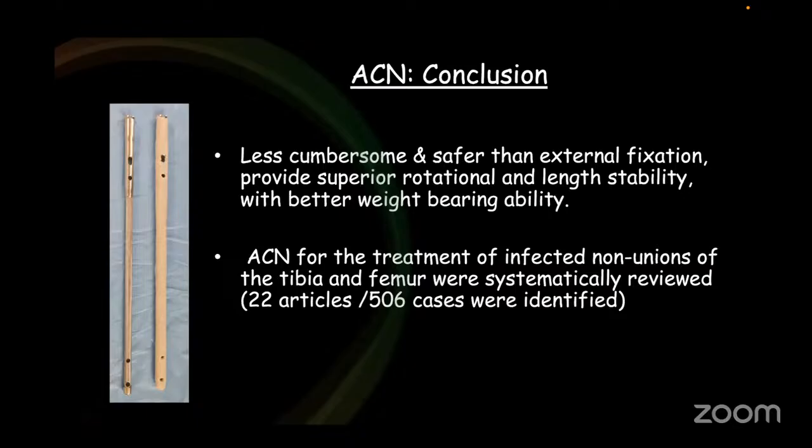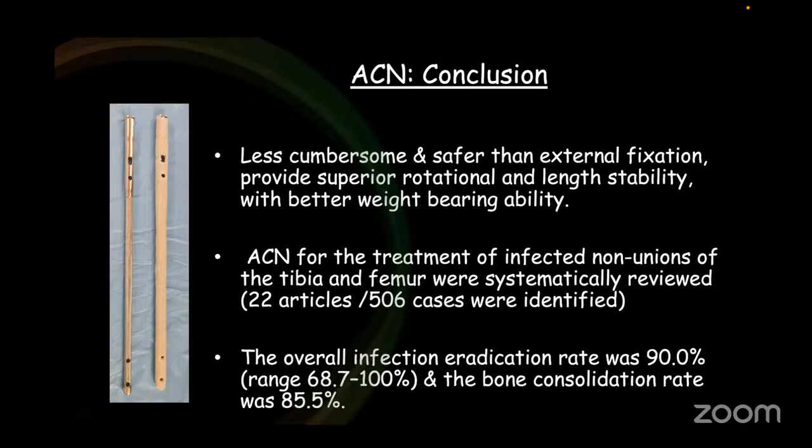It provides superior rotational and length stability because we are able to lock proximally and distally, and because of the cement coating, the size of the nail is quite thick, which gives good axial and length stability and better weight bearing ability.